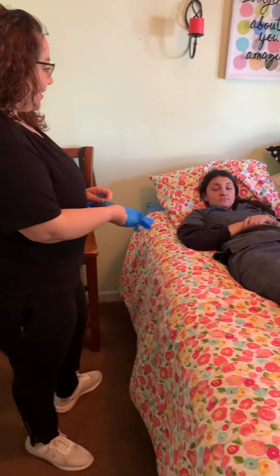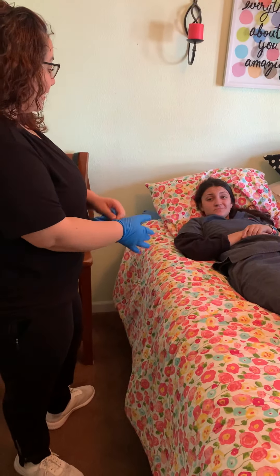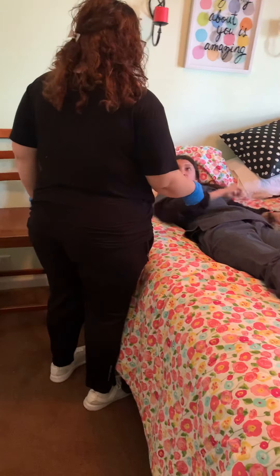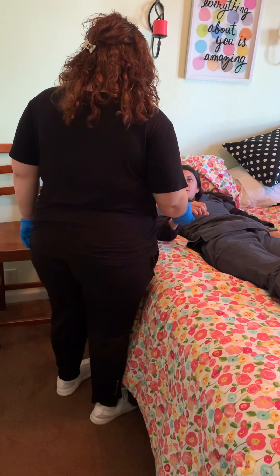Hello, Karen Moniz here. Today I'm going to be showing the skill on how to ambulate the patient and break a fall with the gait belt. First of all, I'm going to make sure to go over the protocol and the policies for this procedure, wash my hands, and gather all the materials, which are already inside. Knock for some privacy.